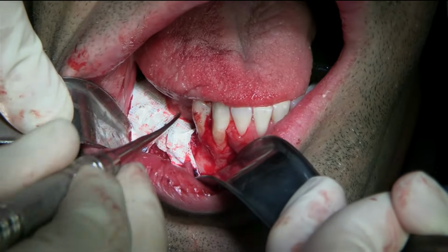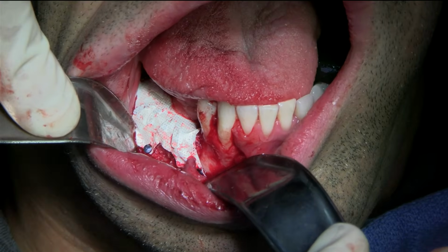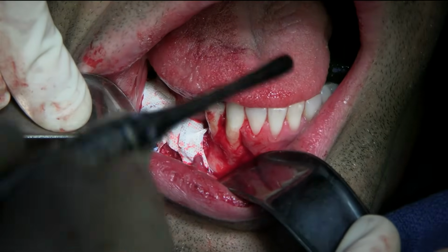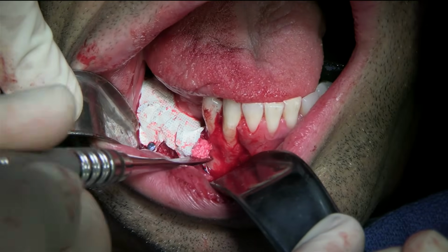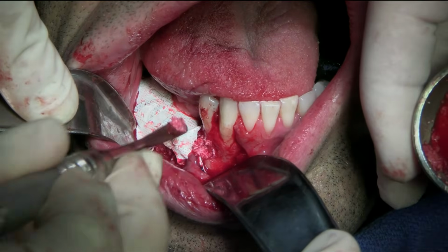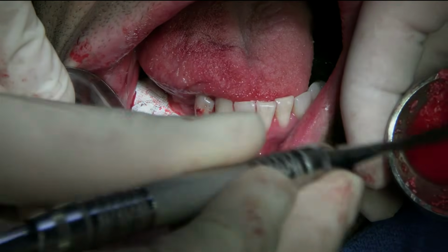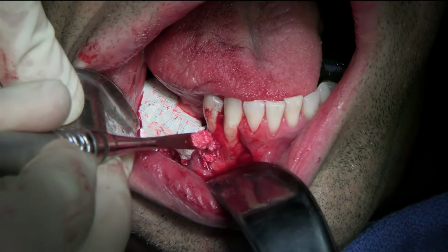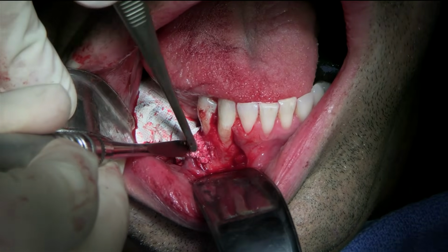Do we still have a little bit of bone? Retract the lingual. Do you have some bone? Retract the lingual. Put it down so you can use. I need you to push it down with an instrument. You take one. Okay.